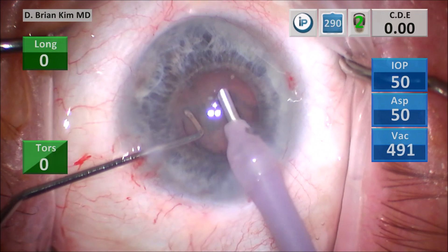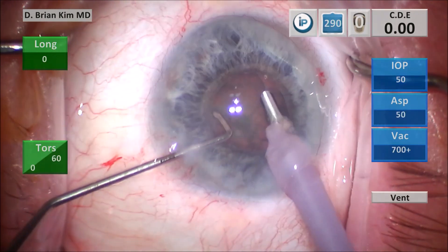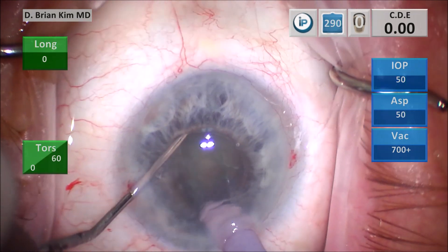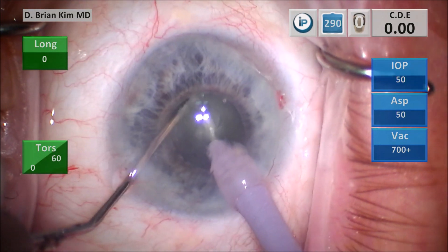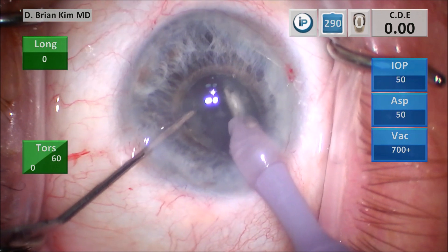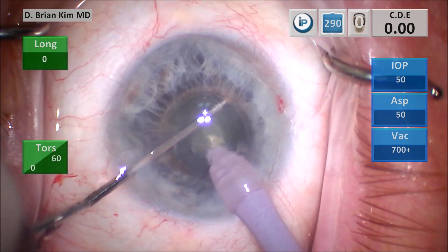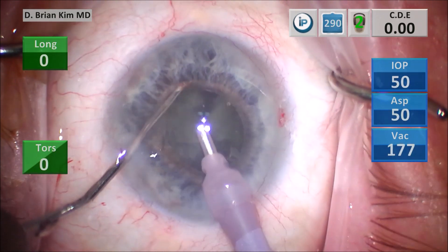Place the chopper underneath the anterior capsular rhexis edge into the fornix. Turn the phaco tip vertically sub-incisionally. Bring both instruments together, crush the lens and bisect the lens in half. Place the chopper out to the contralateral right hemi-nucleus, pull it centrally, crushing it against the phaco tip, and that has divided the right hemi-nucleus.